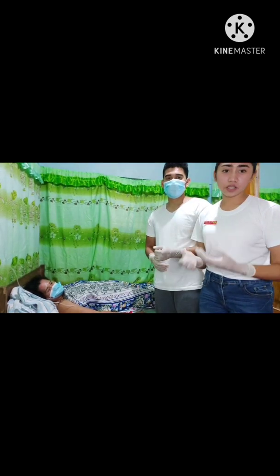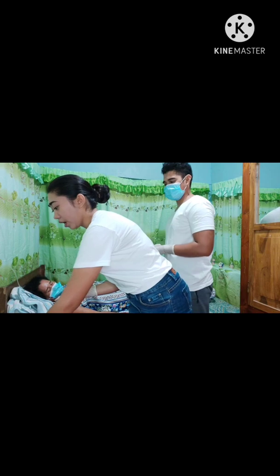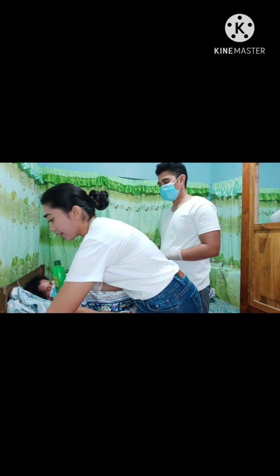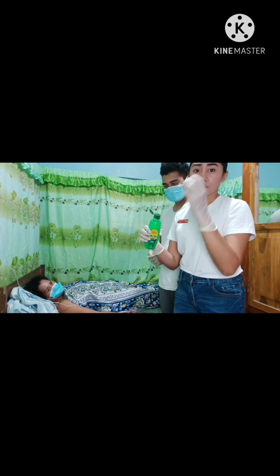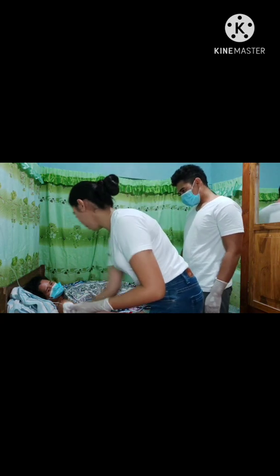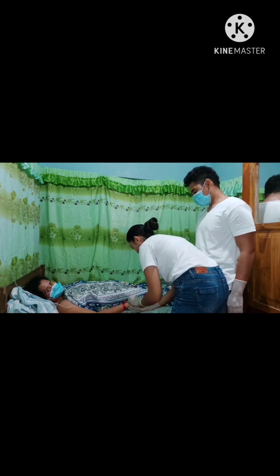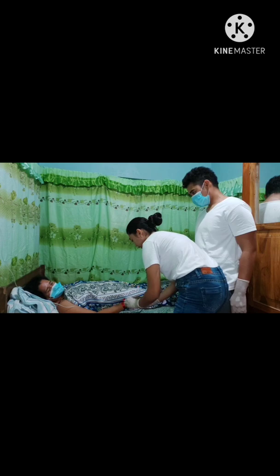So after the doctor has found the vein, we should disinfect the arm of the patient with alcohol and cotton balls in a circular motion from inner to outer. And then make sure not to touch the clean area.